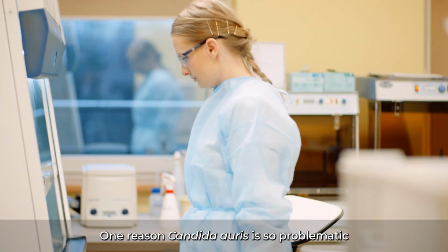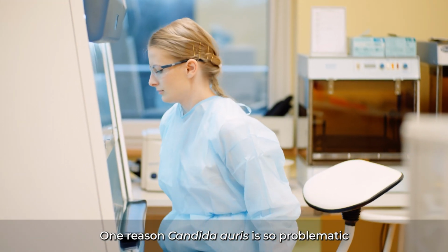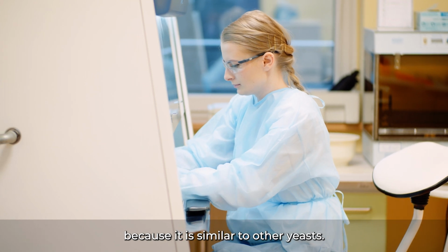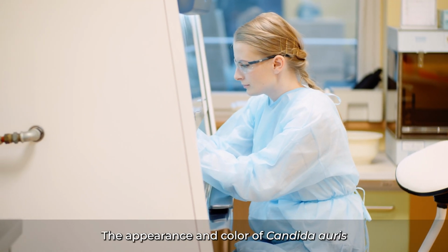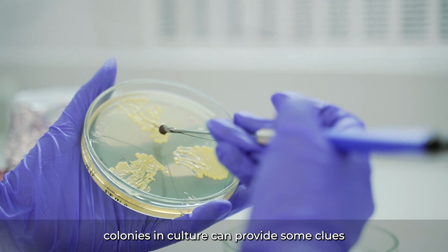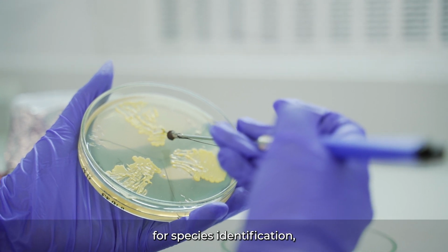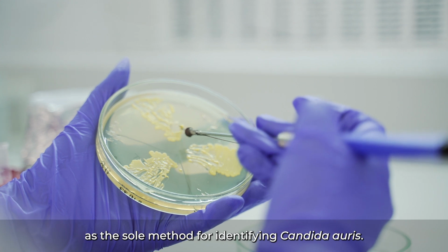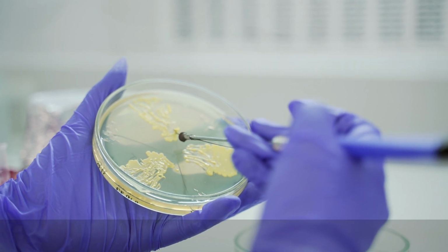One reason Candida auris is so problematic is that it is difficult to identify because it is similar to other yeasts. The appearance and color of Candida auris colonies in culture can provide some clues for species identification, but this should not be relied upon as the sole method for identifying Candida auris.